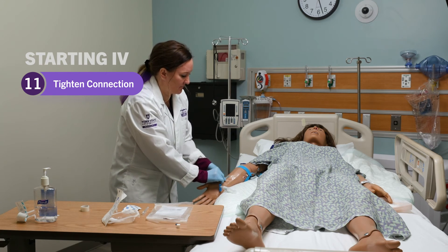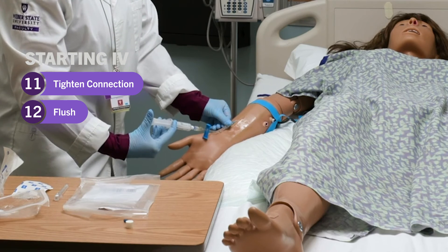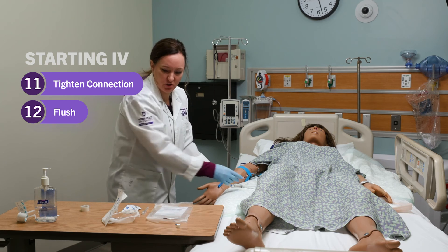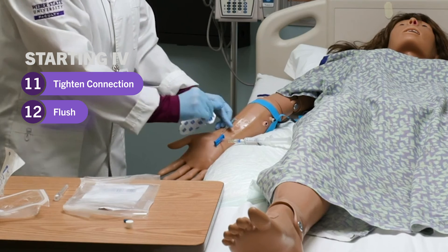Make sure you don't contaminate the site. Then flush, looking for any infiltration or resistance. Once you have a good flush, I like to keep a hand on the IV start.